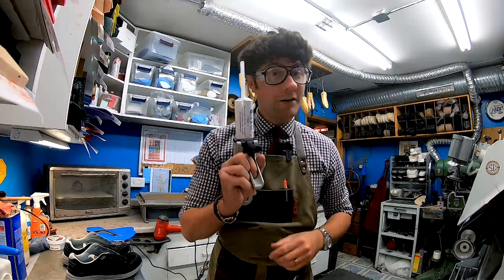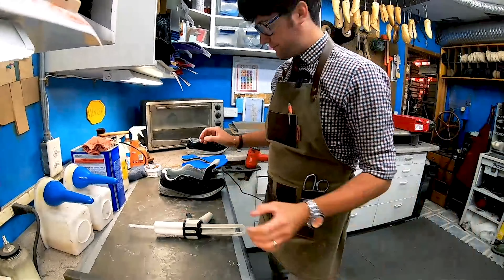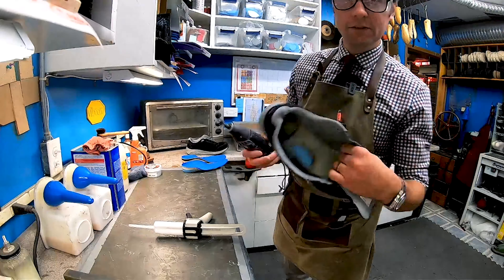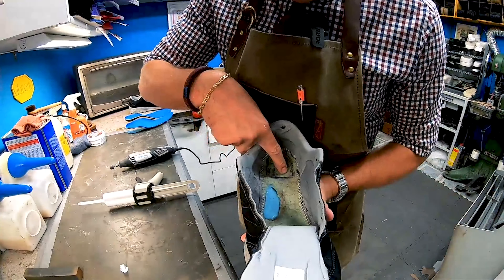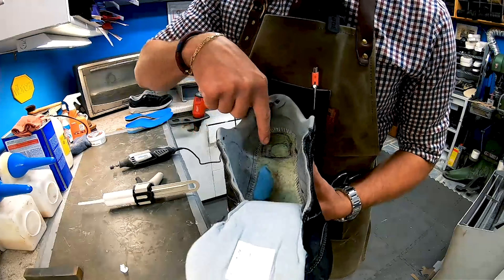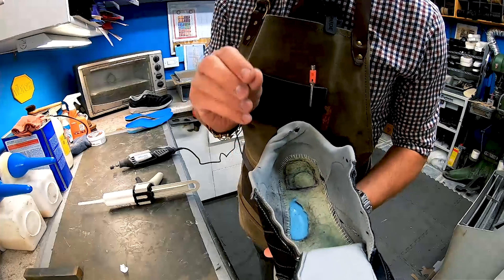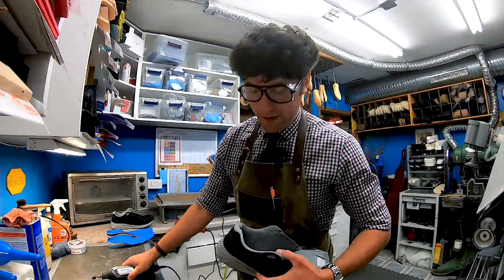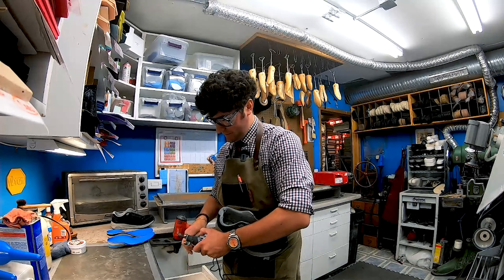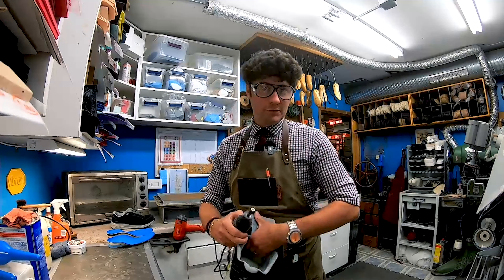The most important part of a drill and fill is the drilling. It's not rocket science — we're going to take a Dremel and excavate the heel. We draw an outline, leaving about a quarter of an inch around the base of the upper, and drill the whole area out going down about a quarter of an inch. When you fill it, you have to be careful not to fill it completely — leave about a sixteenth of an inch of extra space.